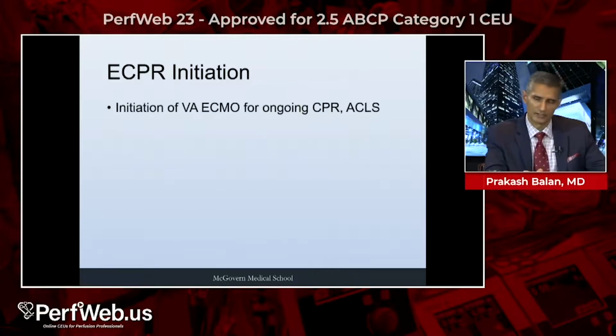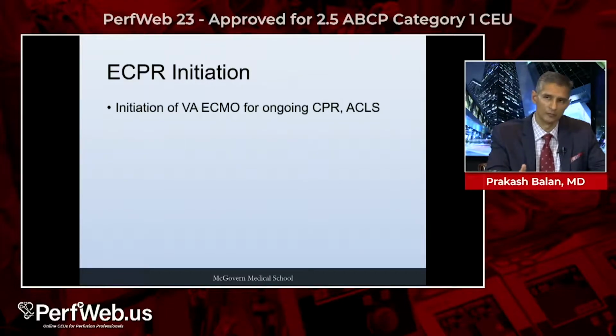I'll make a quick segue into eCPR here because this is an important subset of what we'll be using ECMO for in the setting of cardiac support. This is an area of large research interest for me, and as I mentioned, cardiac arrest is ridiculously common, and we see a lot of young people dying from this. Use of ECMO in this space can certainly improve survival. You can use VA ECMO for ongoing CPR ACLS.